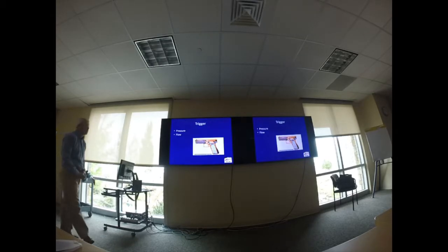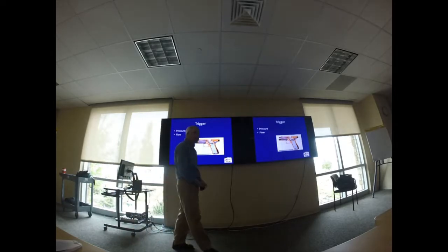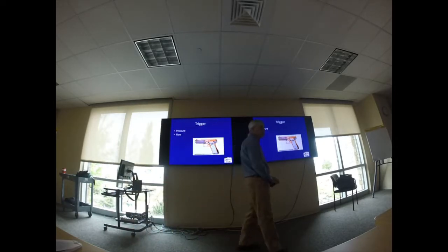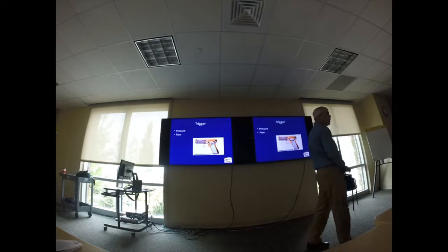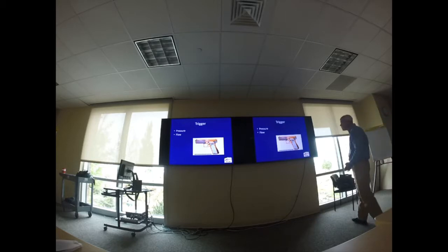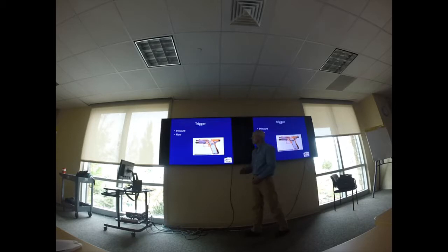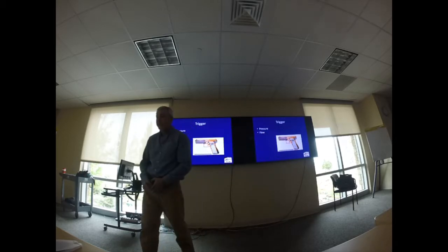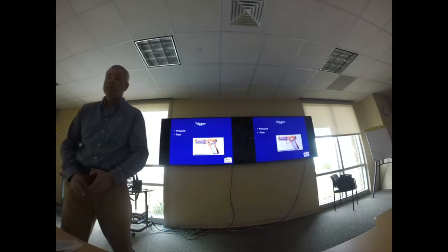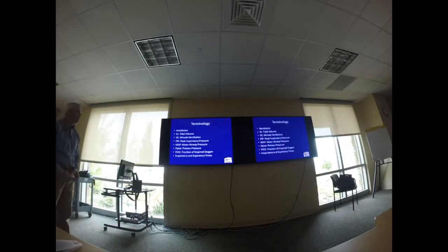So I'm not going to talk a whole lot about trigger. Trigger is pretty much based upon pressure or flow. So the ventilator, depending on which trigger it's using or what type of ventilator it is, determines the pressure, and that's how it delivers a decrease in the amount of pressure, and then it'll deliver a breath based upon that, or the flow, so it'll reach a certain flow and then deliver a breath upon that.